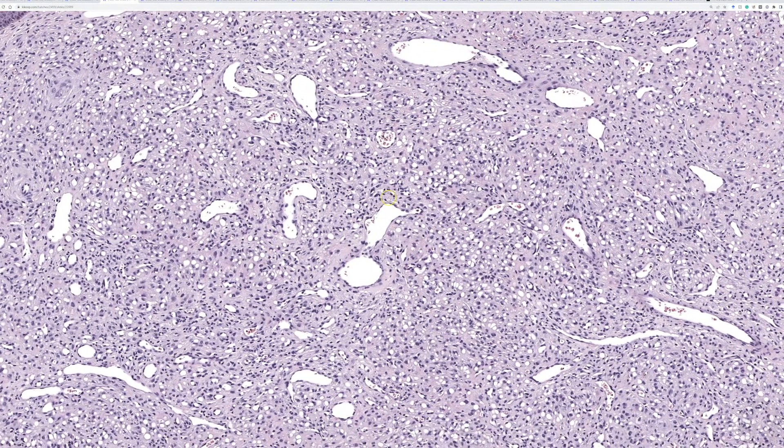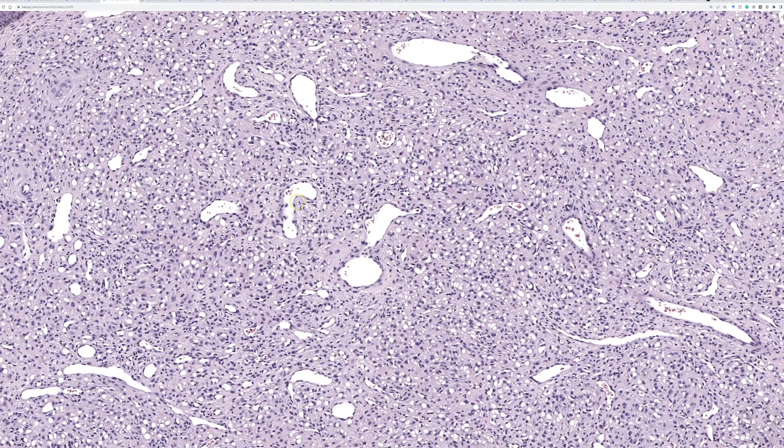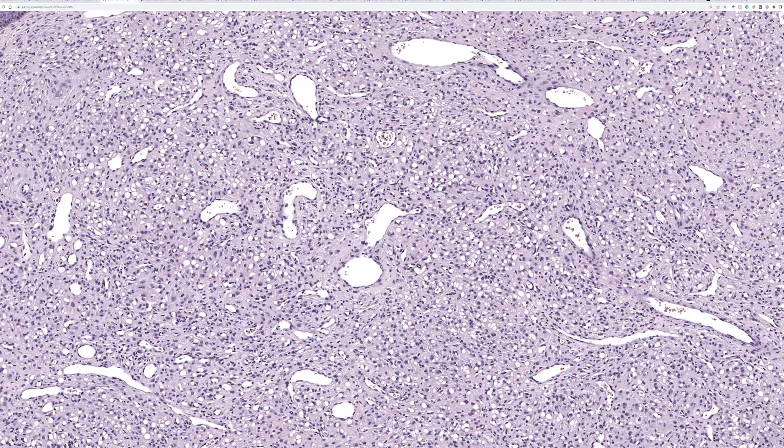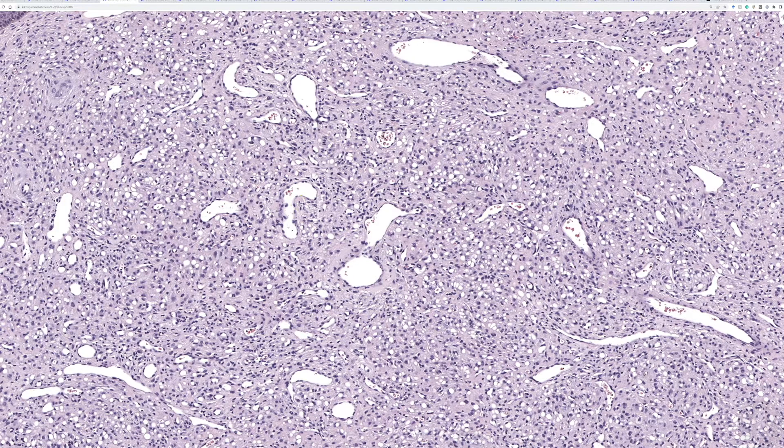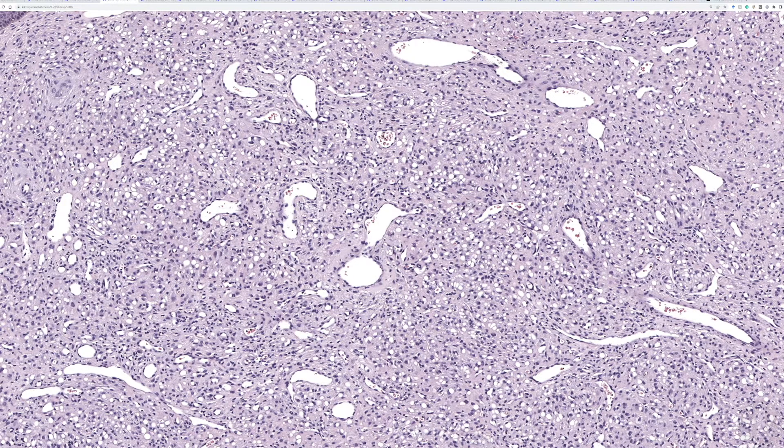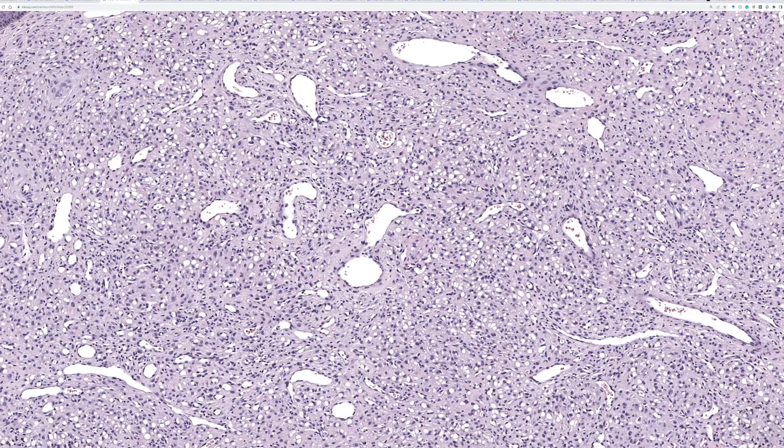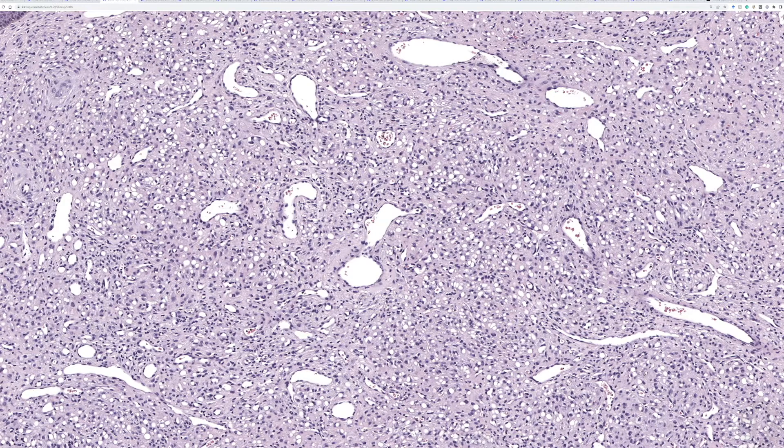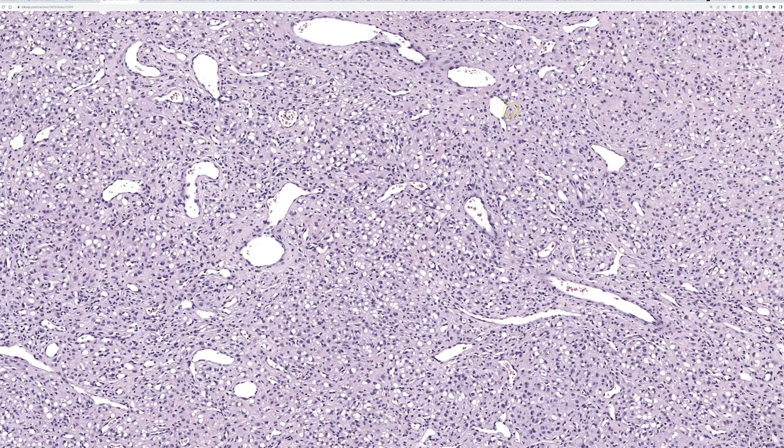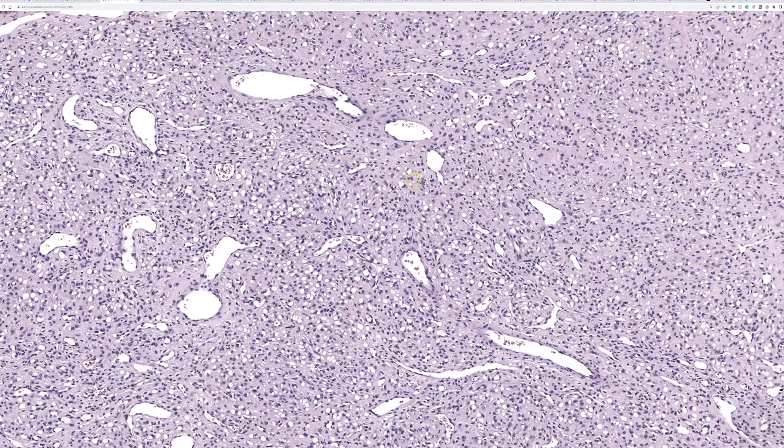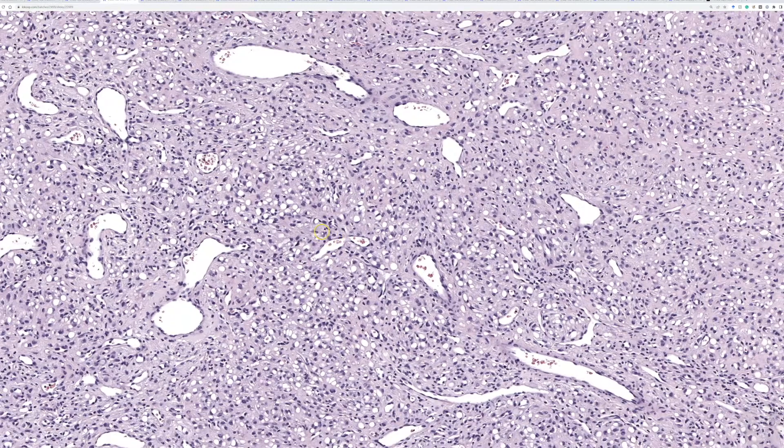This is just a reminder, this case and the last case, a reminder that you can see staghorn vessels in all sorts of different tumors, not just solitary fibrous tumor. It's a useful pattern, but it's seen in a wide range of different entities.